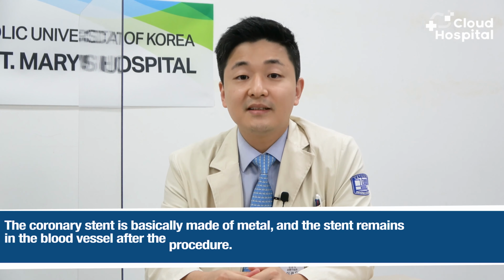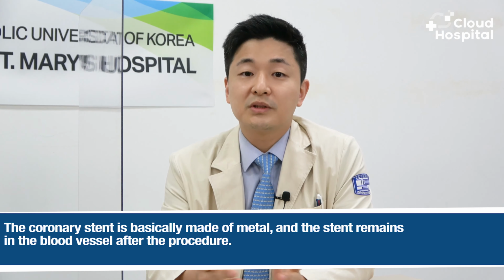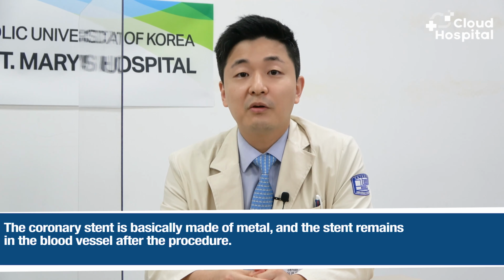The coronary stent is basically made of metal, and the stent remains in the blood vessel after the procedure. The stent is not removed because the flesh grows inside the stent over time. Recently used drug stents are coated with anti-cancer drugs. It continuously inhibits the proliferation of heart artery muscle cells to prevent stenosis.